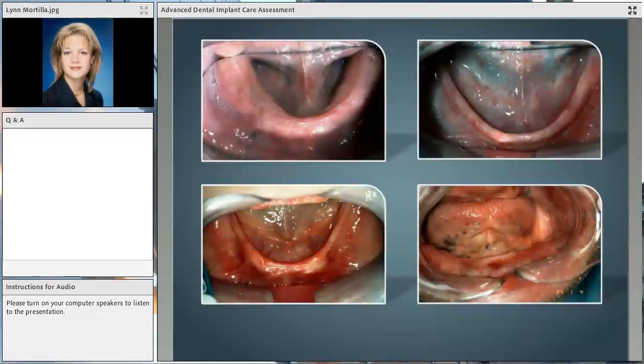Other than the sulcus area, one of the things that clinicians often look at when they're treatment planning is bone. And if we look at these different images here, you can see varying widths of bone, all the way to the lower right where the jawbone has been so resorbed that it's unidentifiable. And this is one of the essences of treatment planning: how much bone is there. And one of the great things is we have wonderful ways of augmenting bone and growing bone for our cases. Based on the patient type and the ultimate long-term goal, we have a lot of different ways to do it.